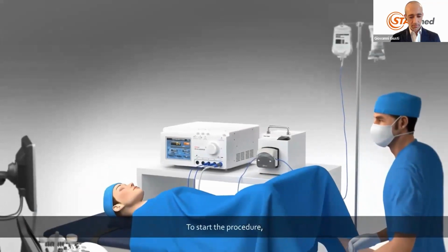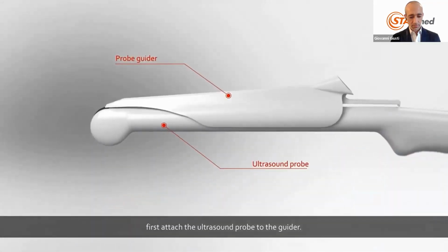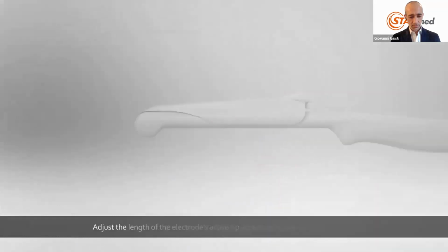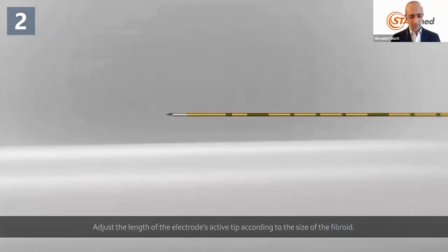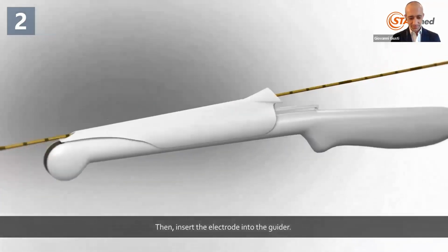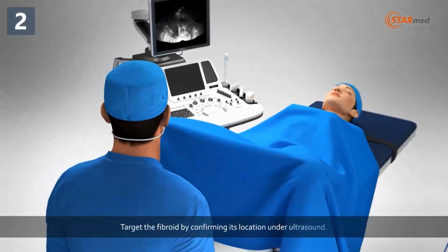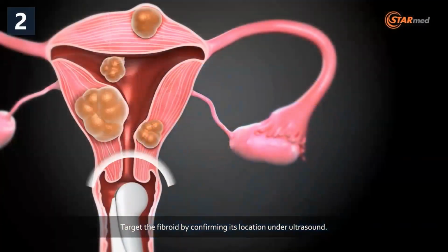To start the procedure, first attach the ultrasound probe to the guider. Adjust the length of the electrode's active tip according to the size of the fibroid. Then, insert the electrode into the guider. Target the fibroid by confirming its location under ultrasound.